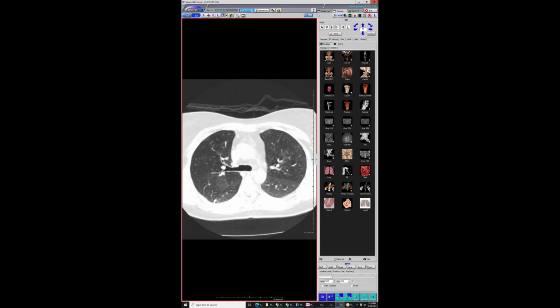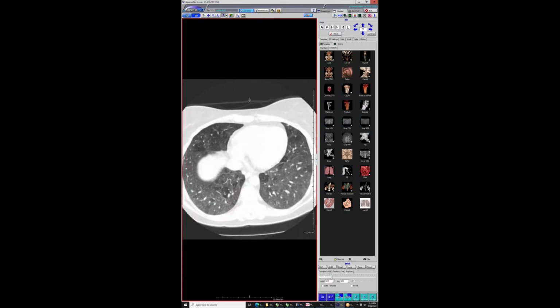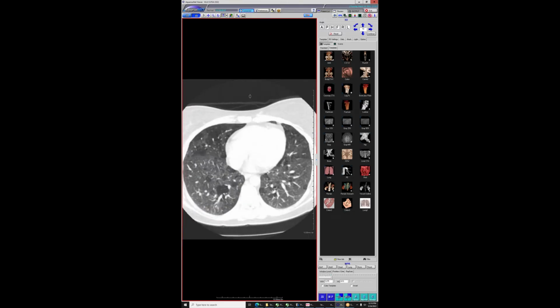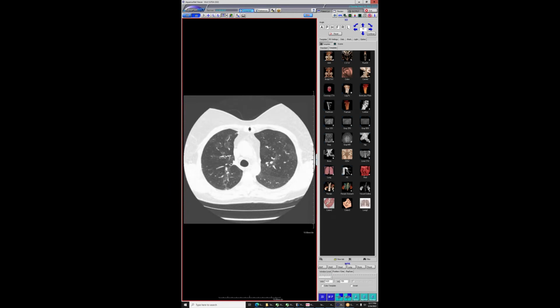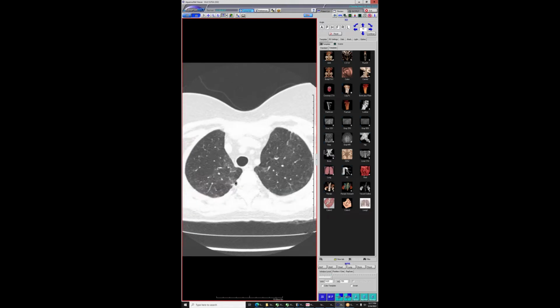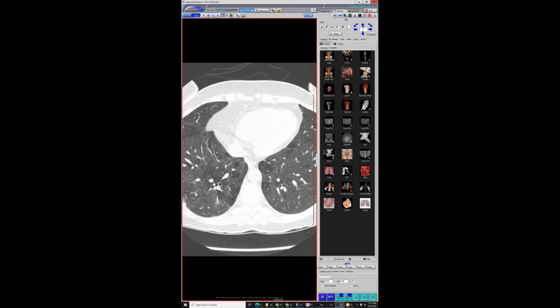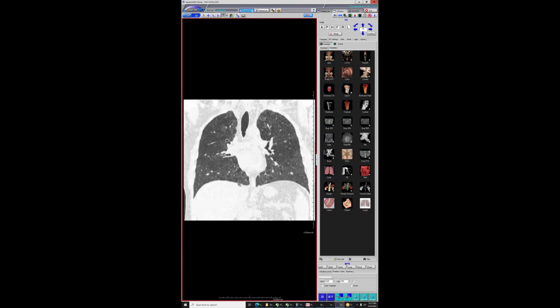So she was a woman from Iraq, and there are questions about whether she has some inhalational exposure there, or something going on there. Anyways, long story short, that first CT came up, and this is now a couple years later, and it looks very, very similar. Some of the centrilobular nodularity in the upper lobes is maybe a little bit better, but it's still there, and she still has the ground glass and mosaicism, which really hasn't changed in many years. And she's been on steroids.